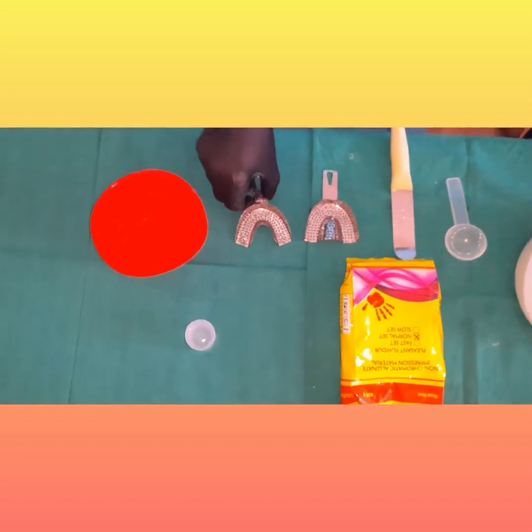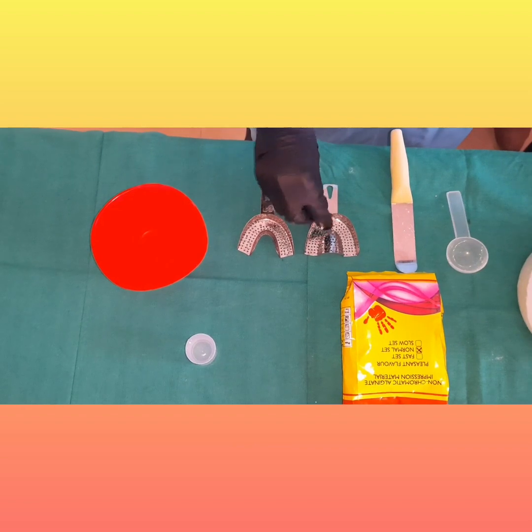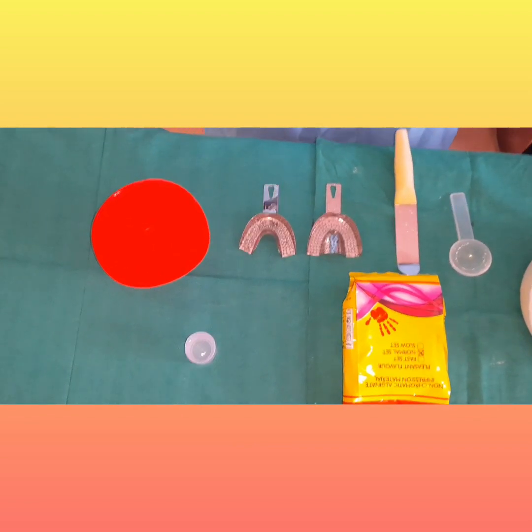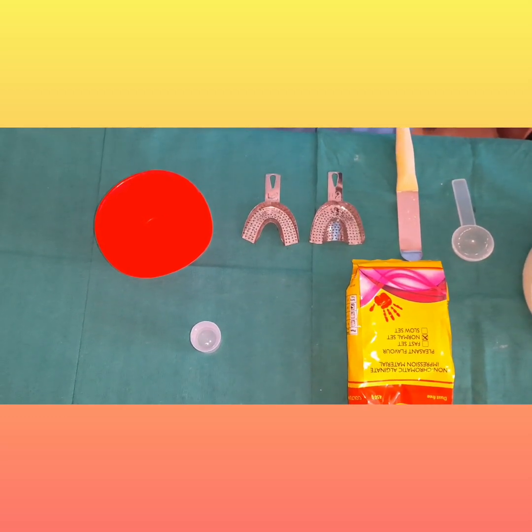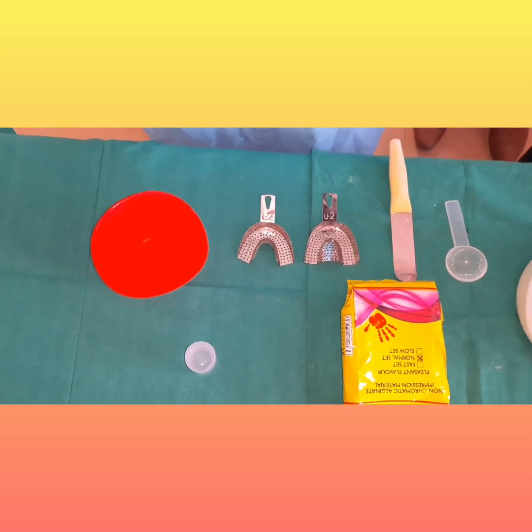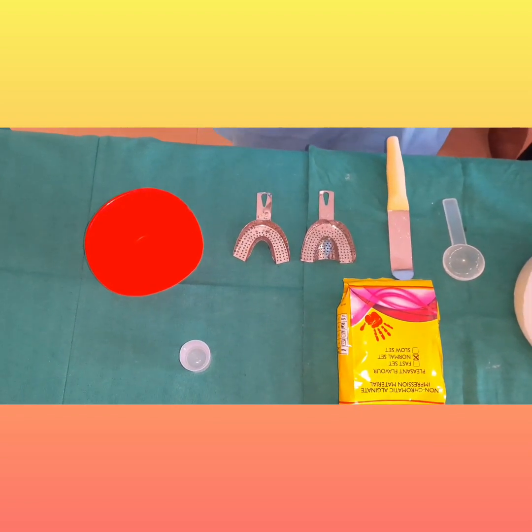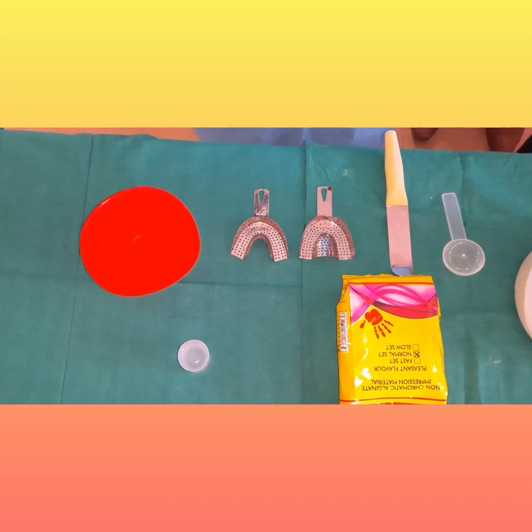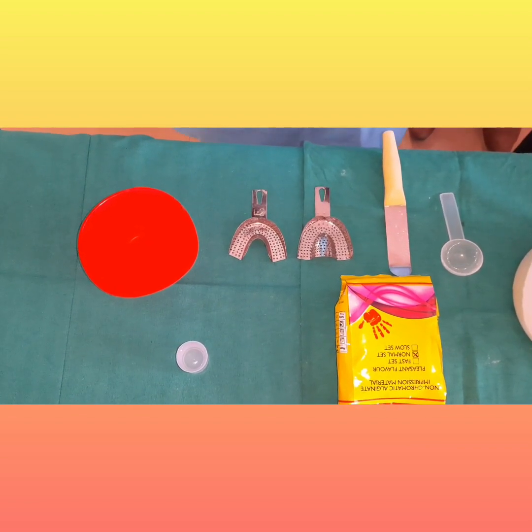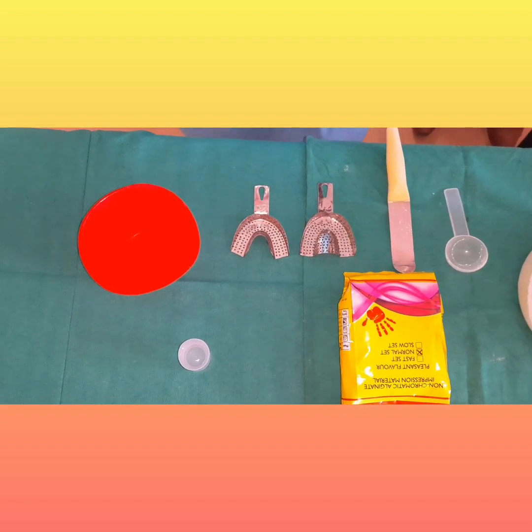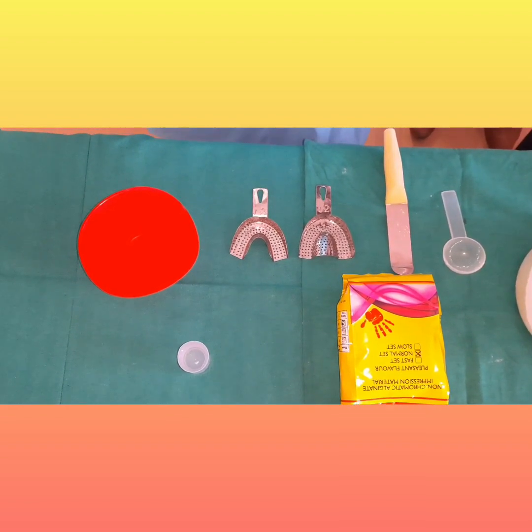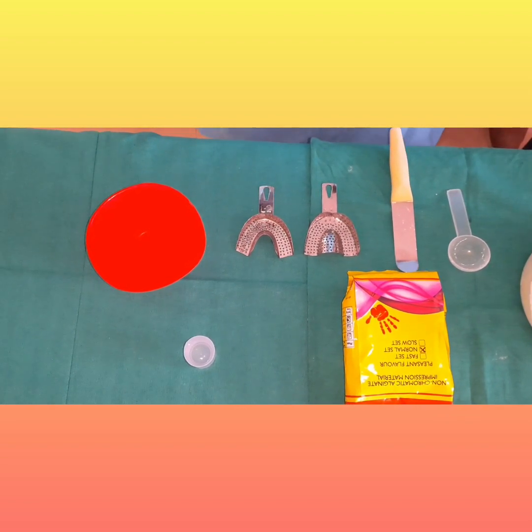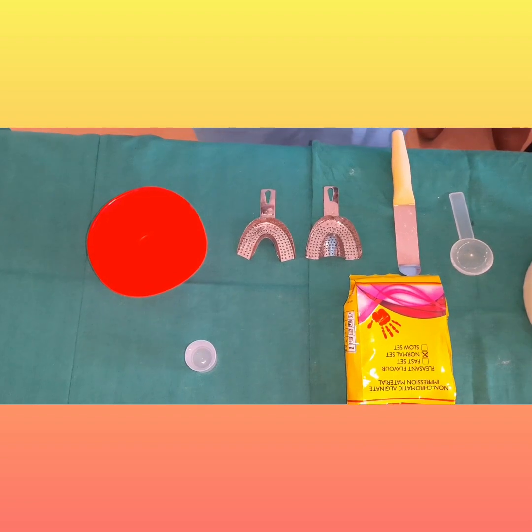These are the selected trays, L2 and U2. Whenever we are making an impression in the patient's mouth, we should go for a lower impression first. The reason is that the patient gets used to the material, chances of gagging are not there, and patient cooperation is better. It is also important to consider the positioning of the patient's head — that is very critical.